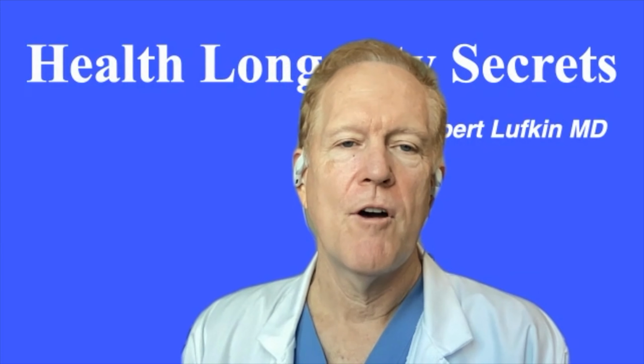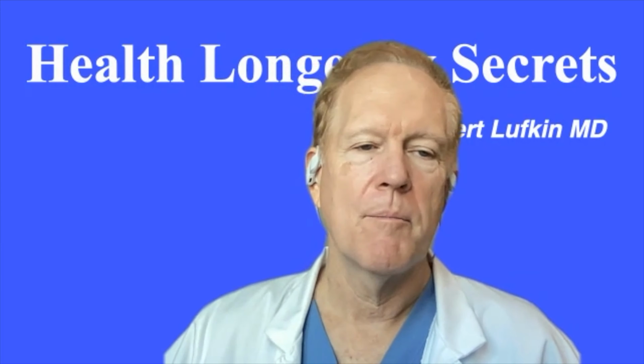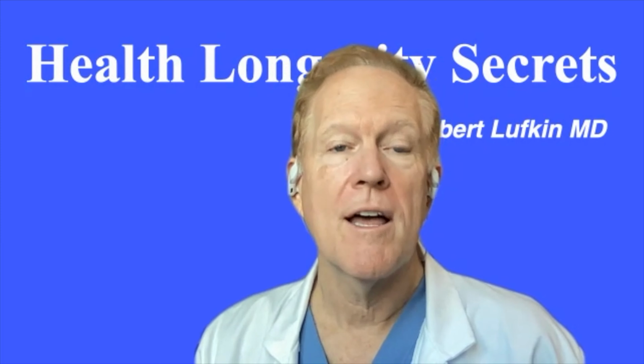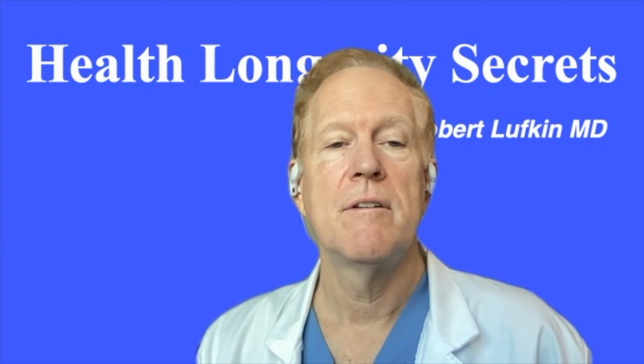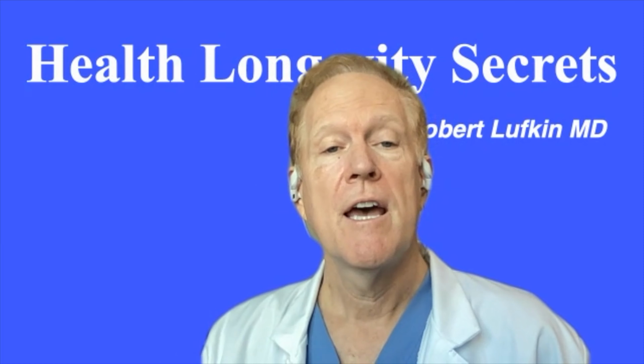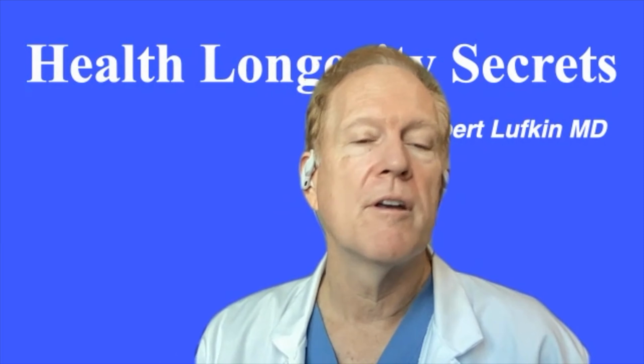Yeah. So a scale basically that we've all used would just tell us our weight, and then we might compare our height with it and get some sort of index there, but it's very crude and doesn't localize at all. Next, we'd have DEXA or bioimpedance type measurements, which could give us a sense of fat and a sense of the body composition, but it's not localized into three-dimensional space, and the quantification is really limited.